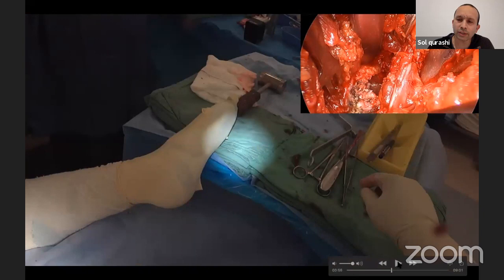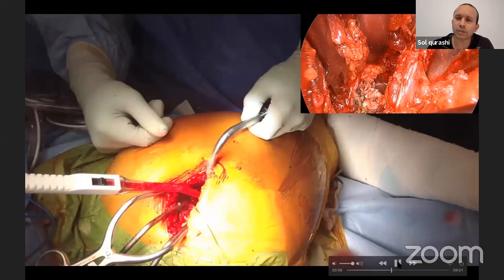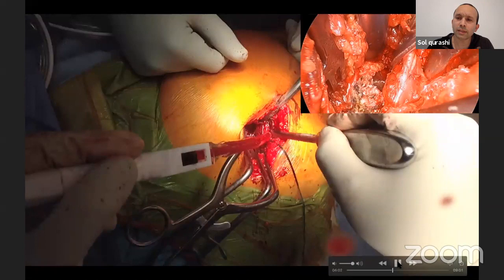That's the anterior leaf of the capsule. That's the posterior leaf of the capsule. There's my intact piriformis. There's just the posterosuperior acetabular wall, posterior wall, and there's my acetabulum in through there. What I'm doing here is just confirming that I'm all right, and it looks like I'm okay. There's the posterior capsular leaf and anterior capsular leaf in front of it.